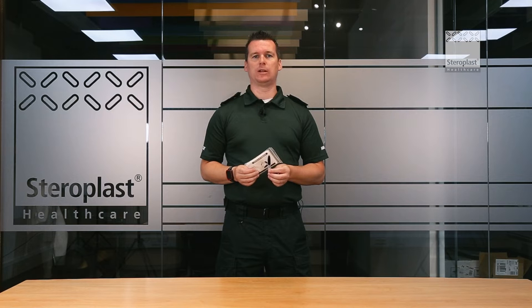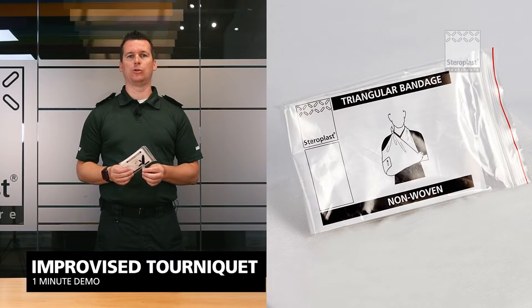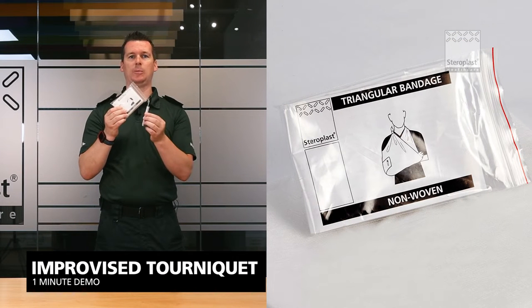Hi, my name's Scott, an emergency medical technician, and we're going to do a one minute demo on how to do an improvised tourniquet using a triangular bandage and a pen.